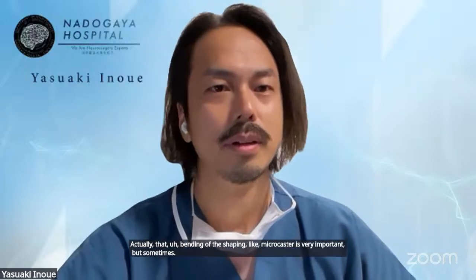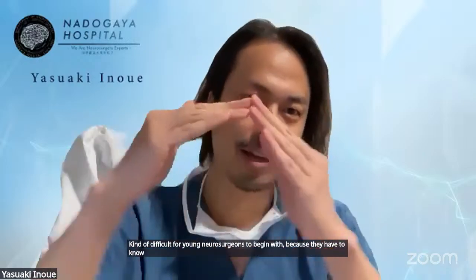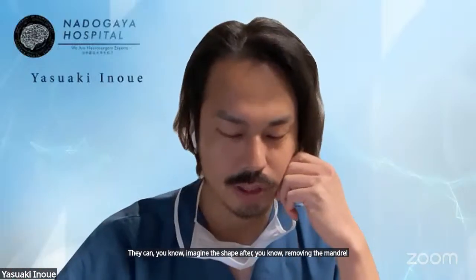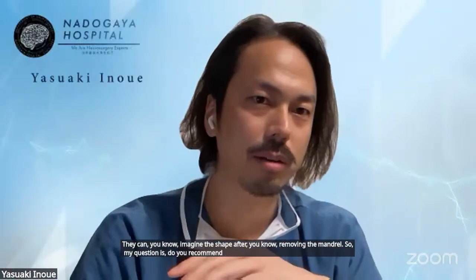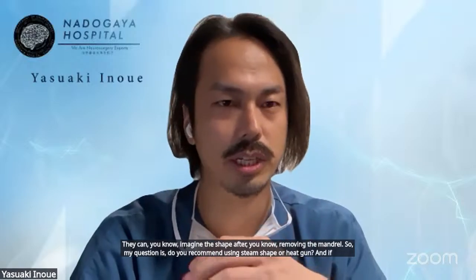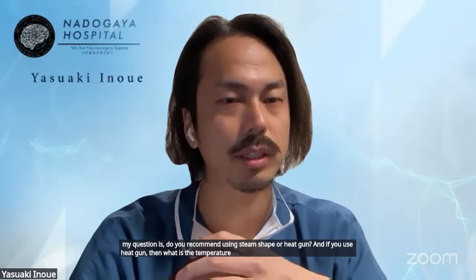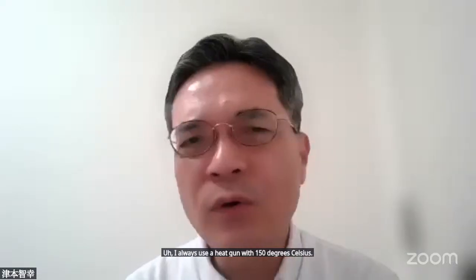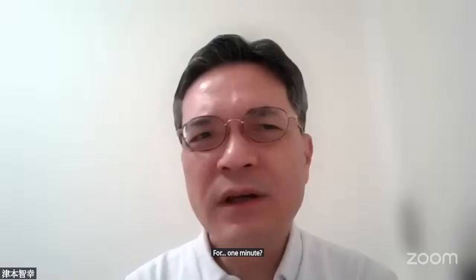Tomo-sensei, thank you so much for your beautiful lecture. Actually, that bending of the shaping of the microcatheter is very important, but sometimes very difficult for young neurosurgeons to begin with because they have to imagine the shape after removing the mandrel. So my question is, do you recommend using steam shaping or a heat gun? And if you use a heat gun, then what is the temperature you recommend? I always use a heat gun at 150 degrees Celsius for 1 minute. It's my routine.